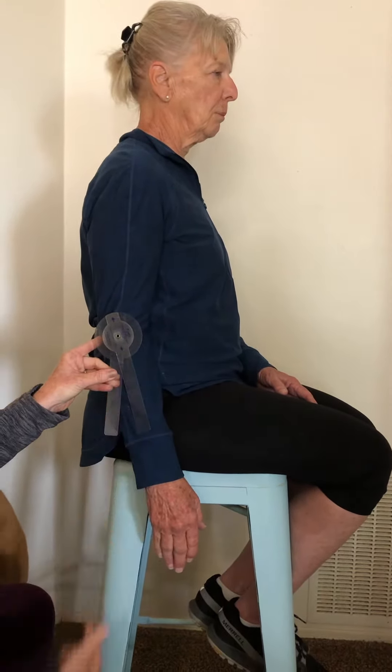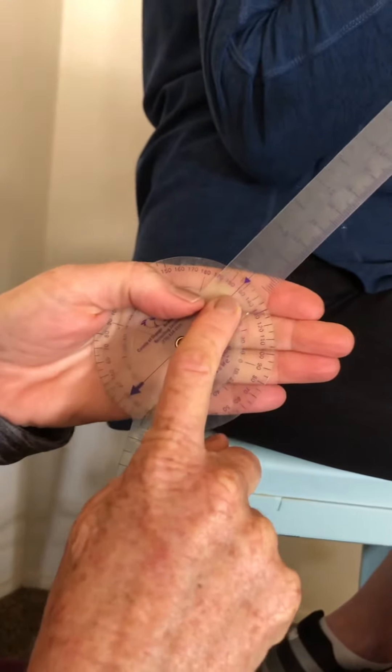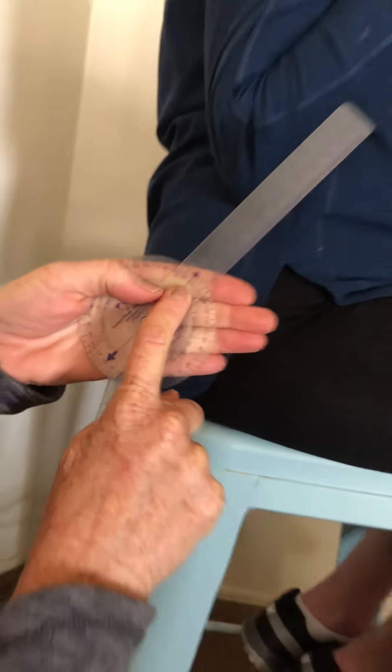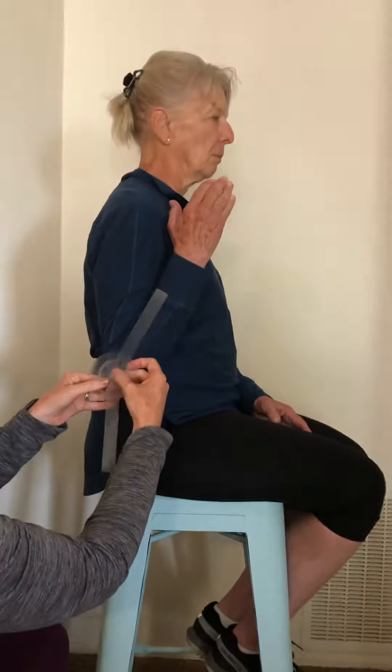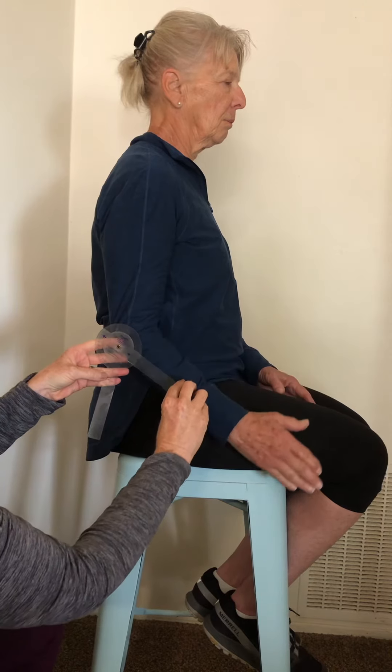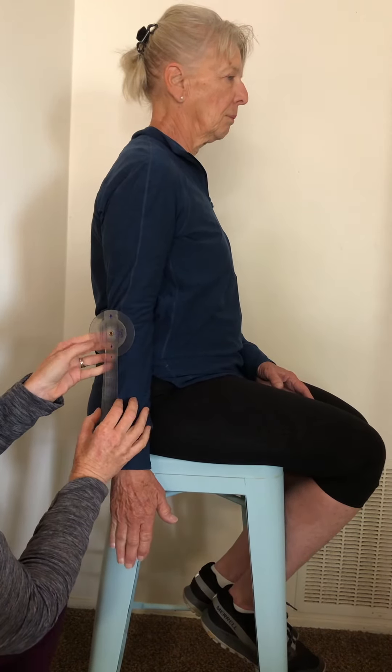I'm going to place the goniometer. I'm going to have her bring her arm down. The goniometer goes at the axis point of the movement of the elbow, that elbow joint. I'm feeling the tip of her elbow with that bend in her elbow there, and kind of going halfway in the middle. This stable arm goes down along the stable line of gravity, and I'm going to move this movable arm.